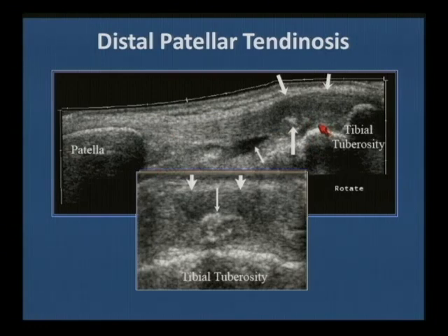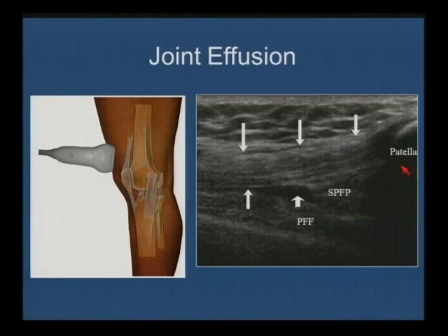It's primarily a clinical diagnosis. We don't image it very much. I'm grateful to Tony Buffard for kindly loaning me these slides. And on radiographs, you see soft tissue swelling over the tibial tuberosity. So that's Osgood-Schlatter. All right, so let's go on now and look at a common clinical reason for ultrasound of the knee. Is there a joint effusion? And we'll go back and we'll look in the suprapatellar bursa.